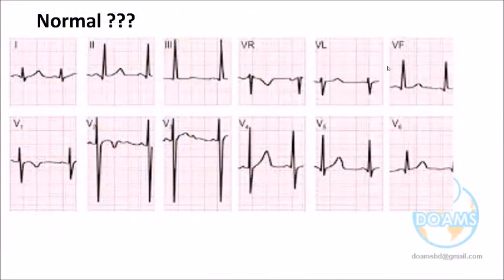Now the true picture of 12 leads of one patient. Here again, the same thing. You see lead 1, lead 2. Compare V1 onwards, and see that the ECG goes from the right to the left. You see R is progressively becoming taller, up to V4 and V5, and V6, being a little more lateral, becomes smaller.